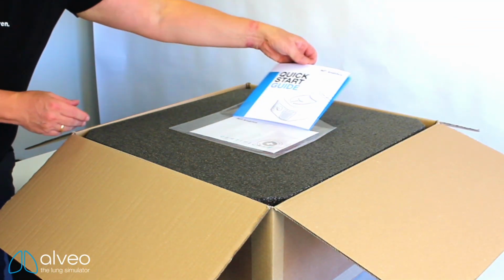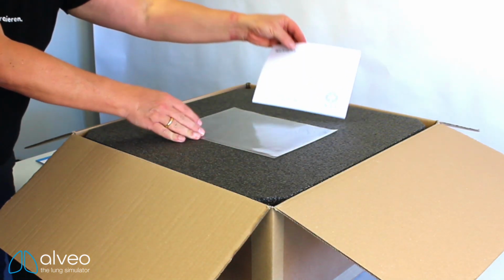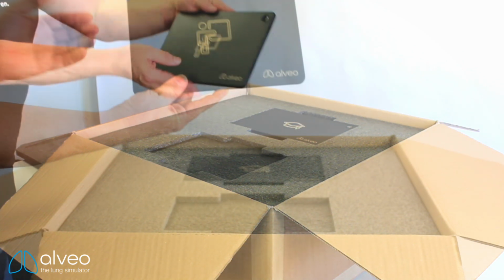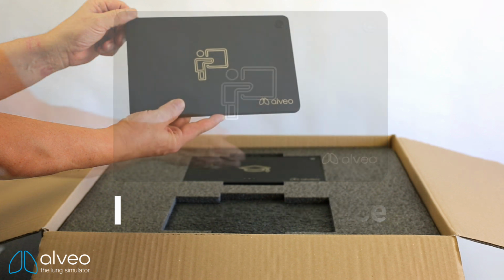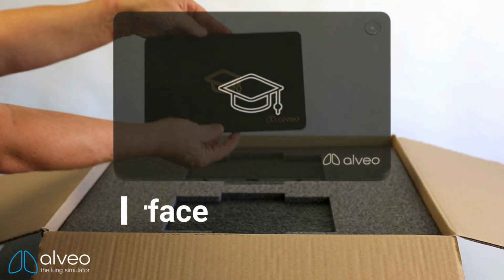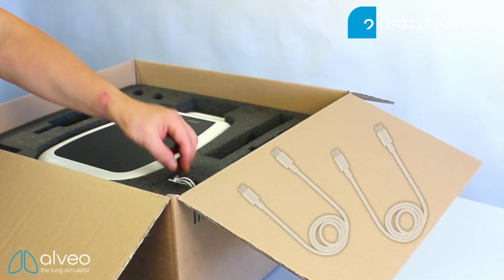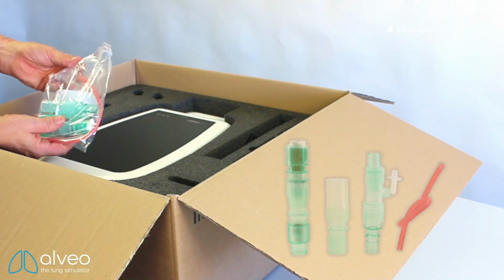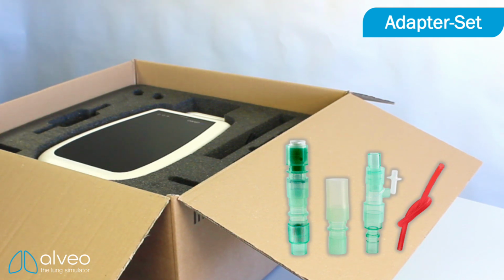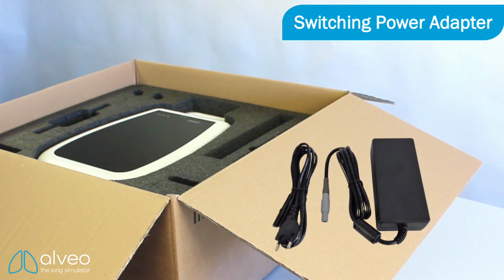Inside the box you will find the quick start guide, the calibration certificate, 2 pre-configured tablets, 1 educator tablet, and 1 student tablet. Two USB-C cables, the adapter set, and the switching power adapter for the alveo unit.